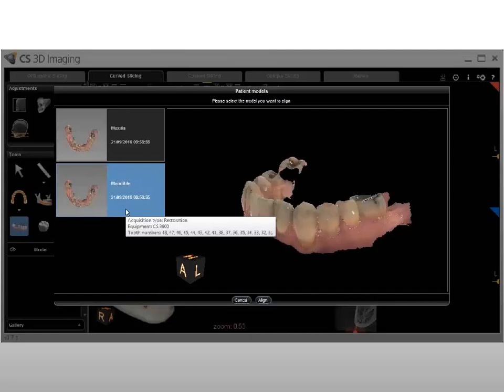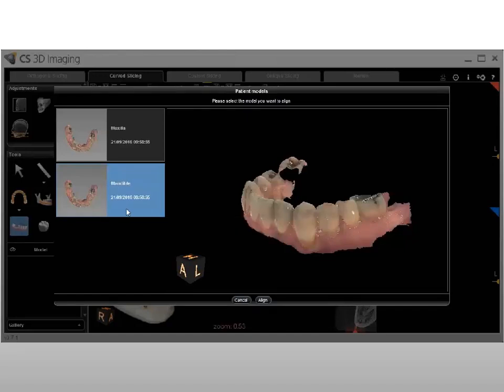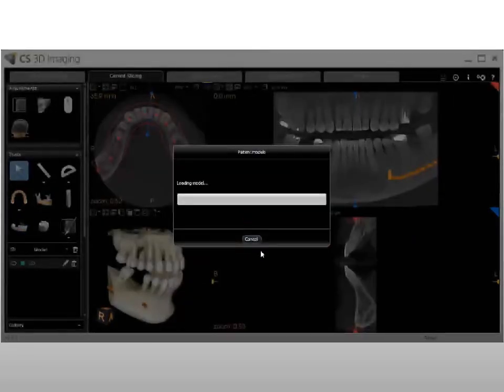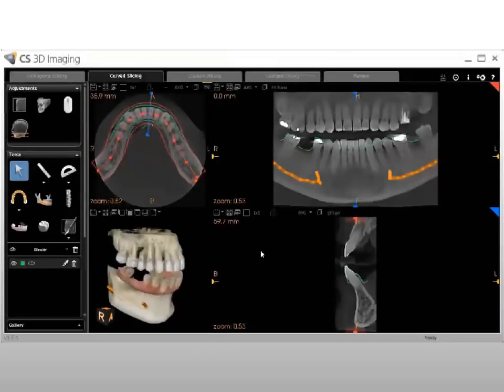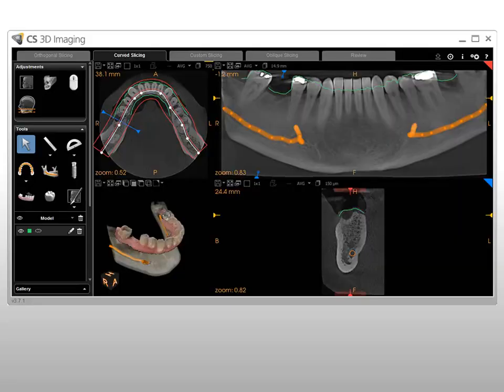In the list of models displayed in the Patient Model side pane, select the model to be aligned to the patient volume. Click Align to launch the automated model alignment process. The CS3D Imaging software launches the automatic alignment of the model with the patient volume. You can add both the maxillary and mandibular models in the volume when required. When complete, the aligned model and patient volume are displayed on the 3D view screen.